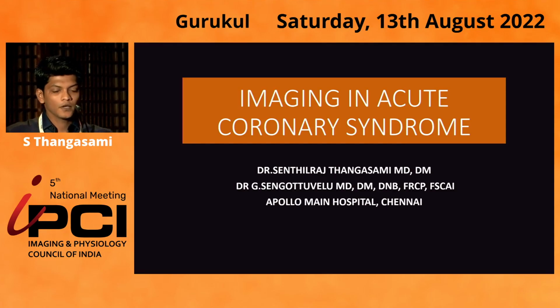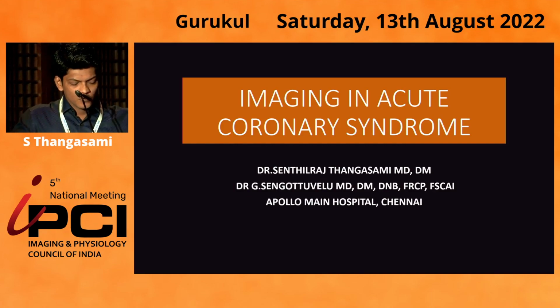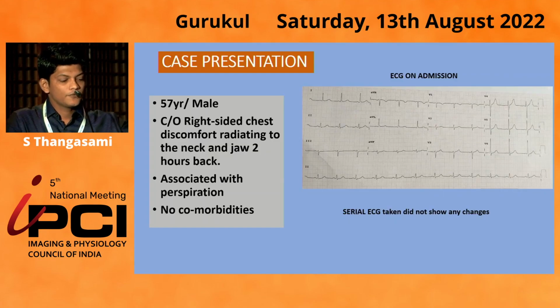Thanks for the opportunity. I would like to present a case in which OCT helped us in deciding the management. I'm Dr. Senthil, working in Apollo Main Hospital, Chennai. My patient is a 57-year-old male, executive by profession.